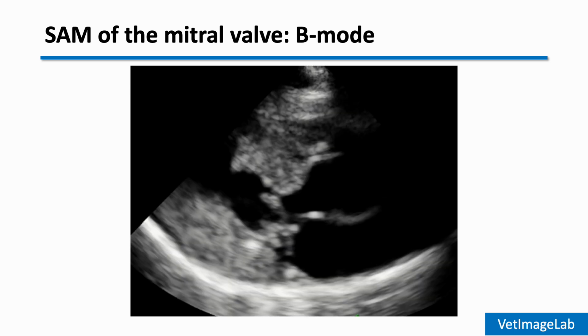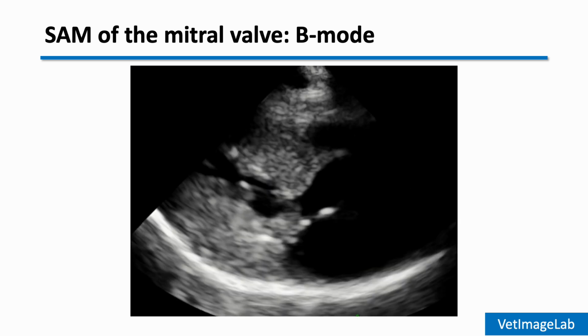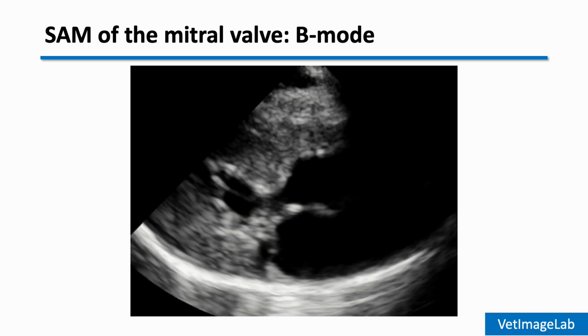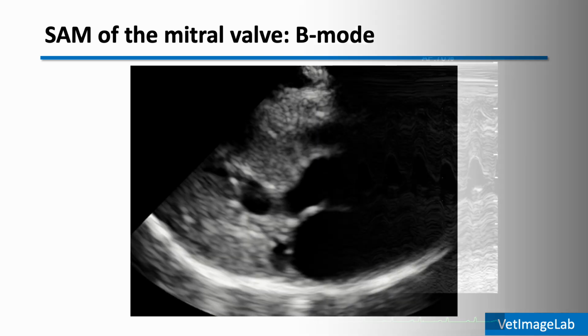Can you see the abnormal anterior motion of the mitral valve in this video? If you use the trackball on your ultrasound machine to scroll slowly through the cardiac cycle, frame by frame, it is much easier to clearly evaluate the motion of the mitral valve.